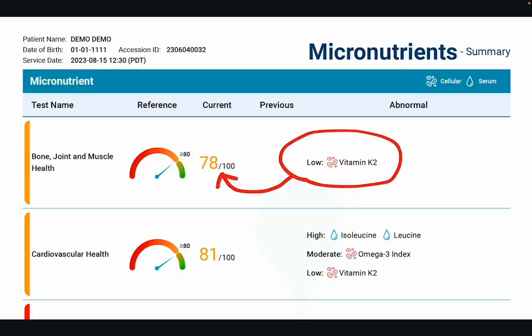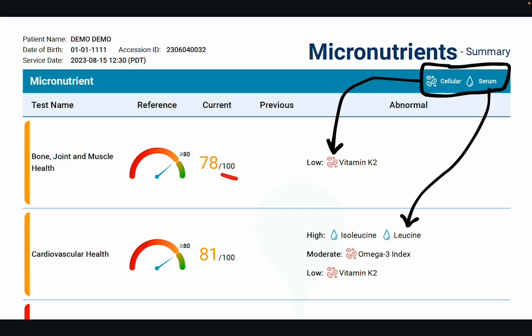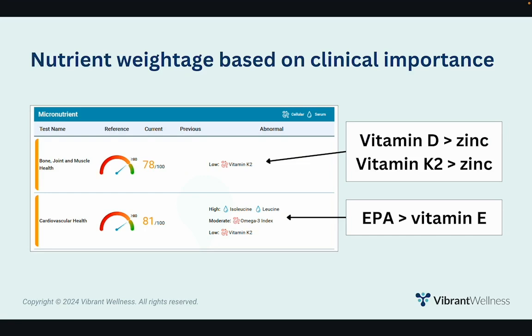In this example, low serum vitamin K2 lowered the bone, joint, and muscle health risk score from 100 to 78, indicating moderate risk for health issues in this category. Red cells indicate intracellular status, and blue water droplets indicate serum levels. Note that risk scores assign different weightage to each micronutrient based on its clinical importance in that category — so micronutrients are not scored or weighted evenly. For example, EPA has a much higher impact on cardiovascular health than vitamin E, and zinc has less impact on bone, joint, and muscle health than vitamins D and K2.